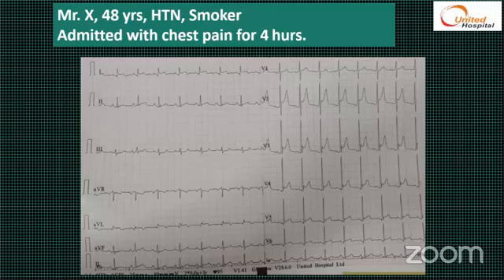Particularly in our place, we have this issue with door-to-balloon times. In doubt, but this is the doubt. If you ask me, I am in Las Vegas, I don't want to bet. But if you want me to bet, I would bet that this could be acute pericarditis. But I don't want to miss an acute anterolateral MI in this patient.